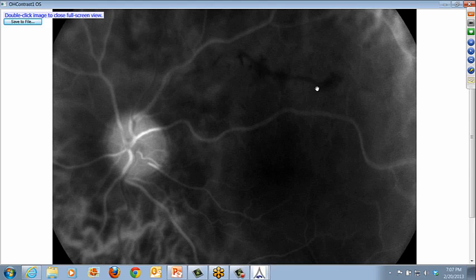obviously deoxygenated blood, so this is not highlighted here. If there were active leaking oxygenated blood, you may see some hyperreflectivity towards the macula because, as we all know, that's a potential space for fluid collection. So the mechanical as well as immunoinflammatory reasons that fluid will collect there. And so you cannot always perfectly rely on determining whether or not there is CME there.